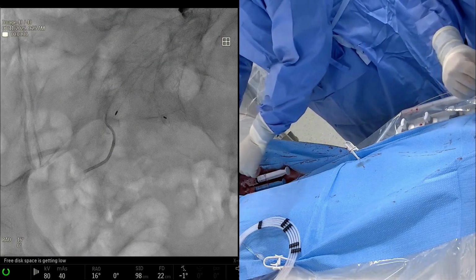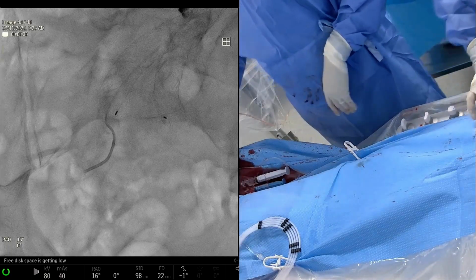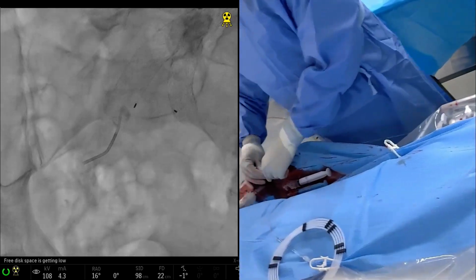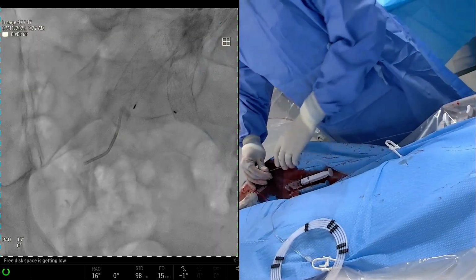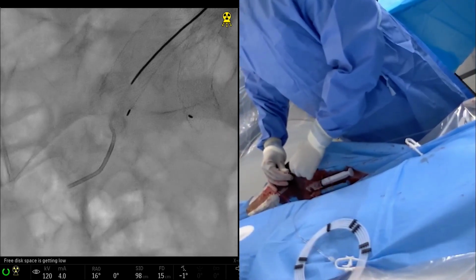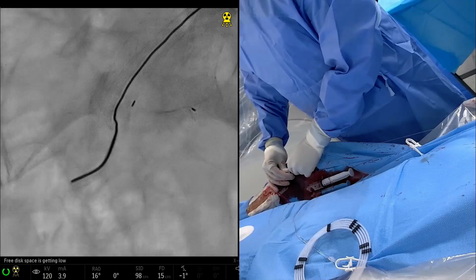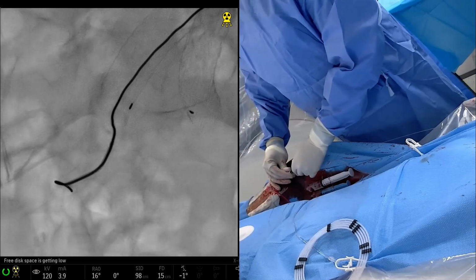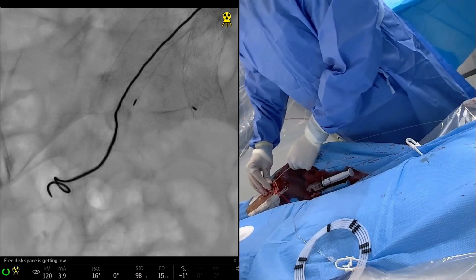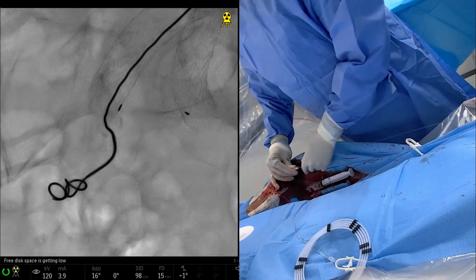Okay, so we're going to take this out. We're going to save this orange hoop just in case this coil doesn't work. We can always re-hoop it. I'm going to mag up a bunch just so you guys can see this coil come out. Here it is. Man, that is a huge coil. The coil forms pretty well there. I like it. Yeah, that's perfect, right?